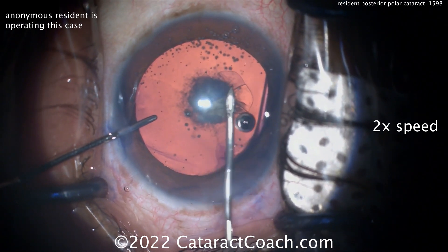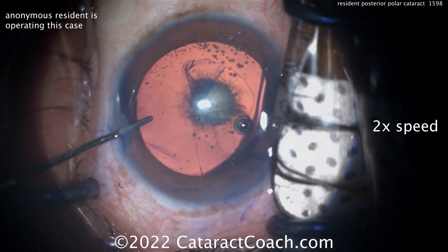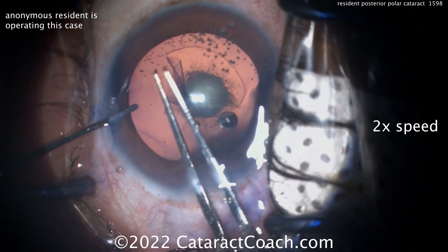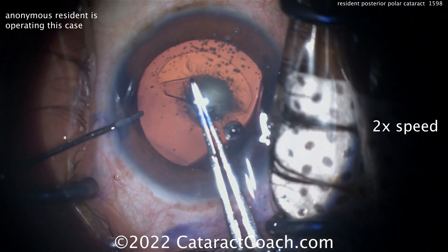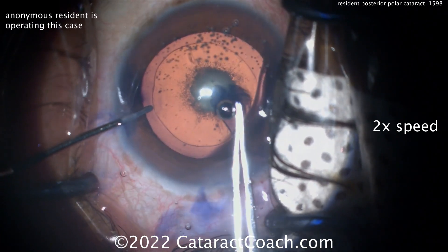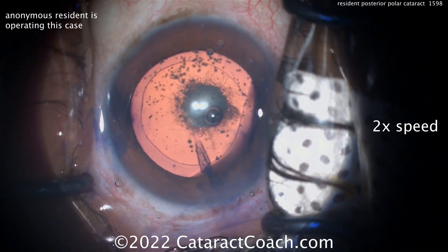In a case like this, do remember that at the site of the posterior polar opacity, that posterior capsule can be weak, fragile, or even frankly absent. Studies published by Abhi Vasavada and Bob Yosier show us that about a third of these patients can experience a capsule rupture at the time of surgery.